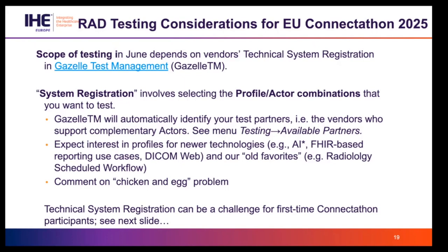So I would expect, in fact we are already seeing, because registration is ongoing, that we will have interest in newer technologies. I see some registrations for the integrated reporting applications, for the AI results, as well as our old favorites, radiology scheduled workflow.